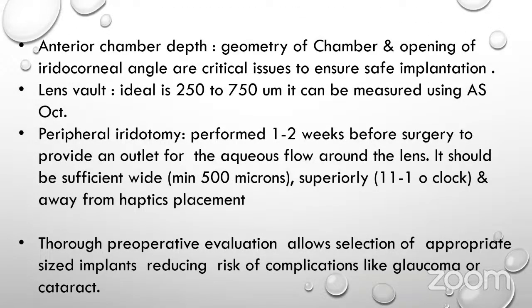Anterior chamber depth, geometry of the chamber and opening of the iridocorneal angle.